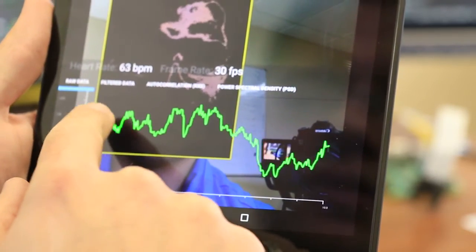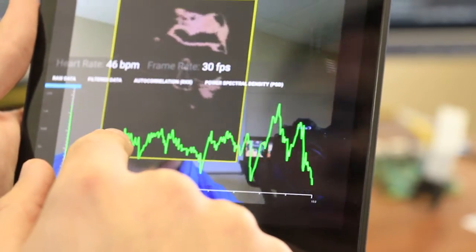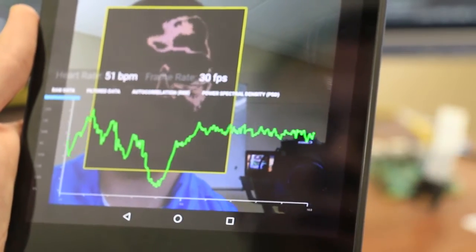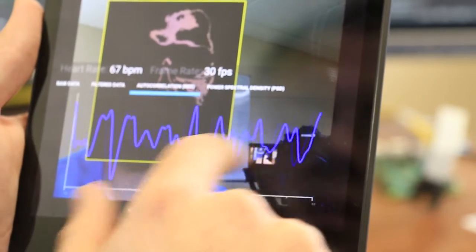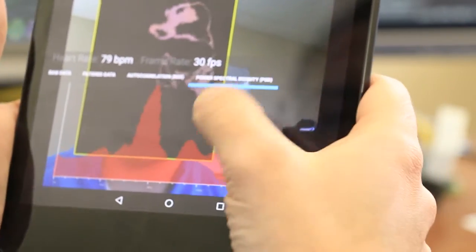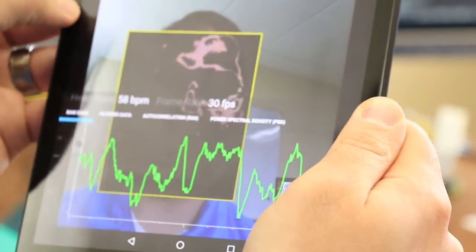As you can see, there's definitely parts that look heart rate-like, and there's parts that change quite a bit due to just my head moving around or other lighting changes, cars driving outside. Anything that changes the light in the scene ever so subtly will change what the signal looks like. So I bandpass filter it, compute an autocorrelation, and here's my power spectral density. As you can tell, it's all over the map. I don't believe it's accurate, and that's all due to the motion artifacts introduced by me just moving around. Even my hand shaking a little bit.